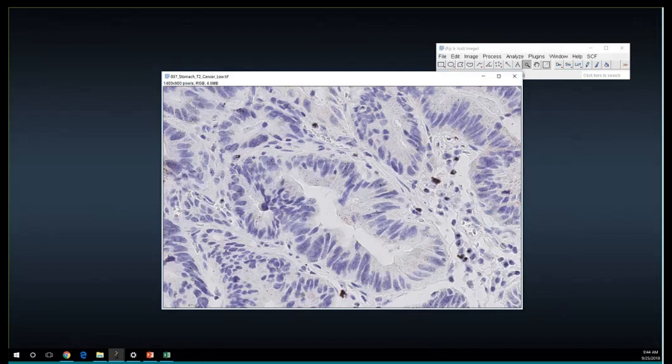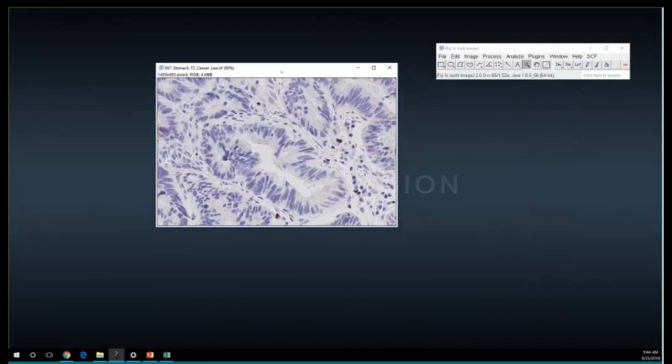Now, please note, for this demo, I didn't eyeball the accuracy of the classification, but in a normal situation, what you want to do is keep optimizing your classifier until you really are almost sure you detected most of the dots, and you're not over-segmenting or under-segmenting any of these classes. And that will be it to report the average dots per cell for an entire image using ImageJ and using the singleplex chromogenic assay.